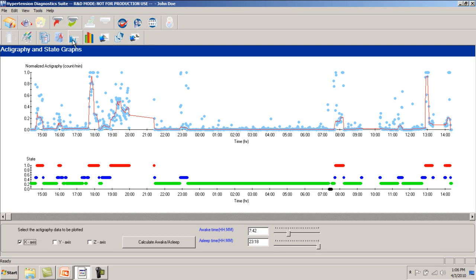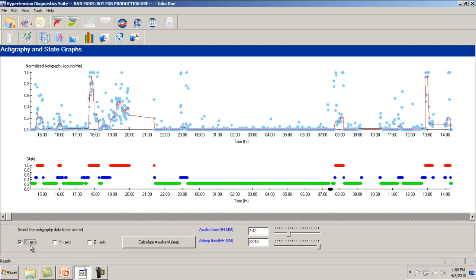If the accelerometer has been enabled upon initial device configuration, along with blood pressure measurement, the device will collect actigraphy data. This data is collected once a minute for each of the three axes of motion: up and down, forward and back, and side to side. This data is presented as blue dots on the top portion of the actigraphy graph.